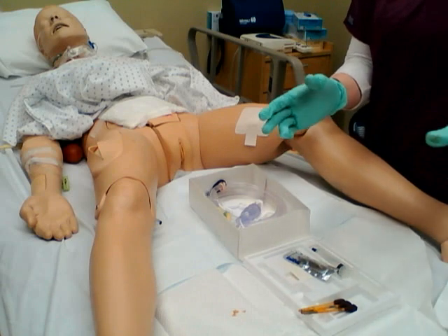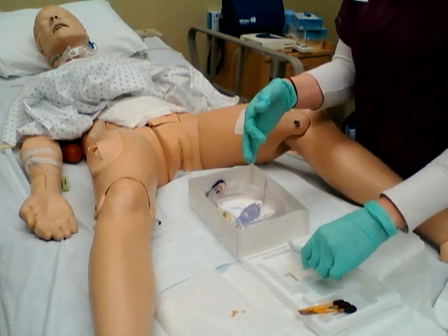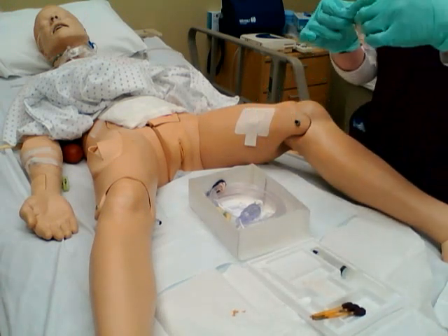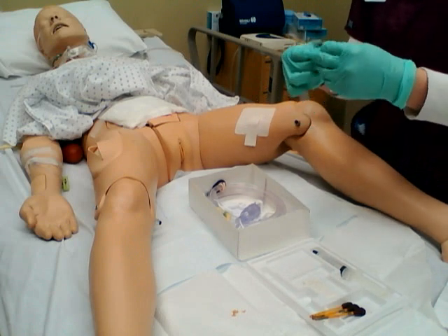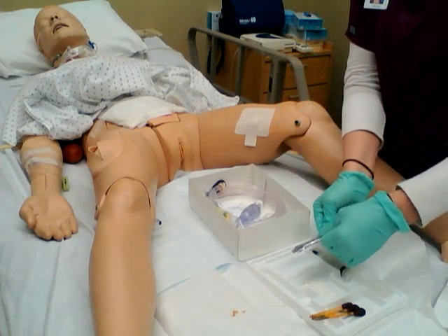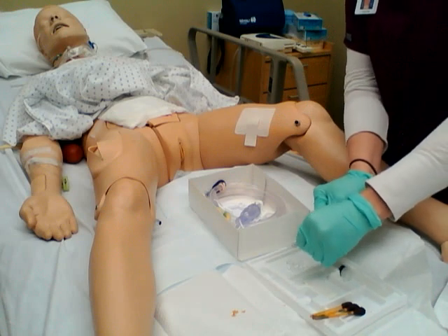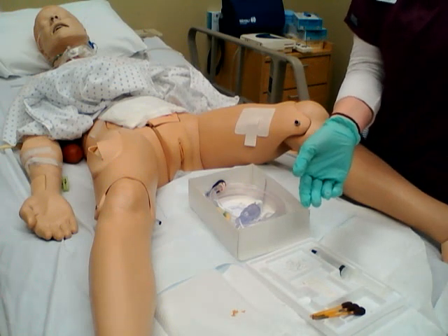I'm going to throw this off to the side because this is garbage, and I still have my hands sterile. Now I'm going to open my lubricant. Disposing of any garbage, just throwing it off to the side. Also, for the sake of the validation, I won't actually be using the lubricant.